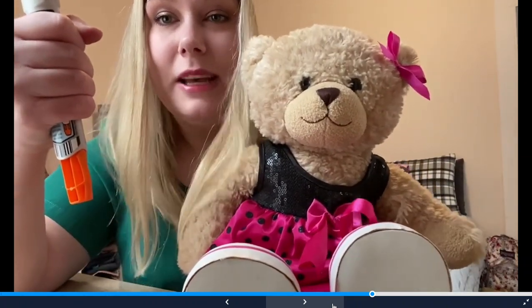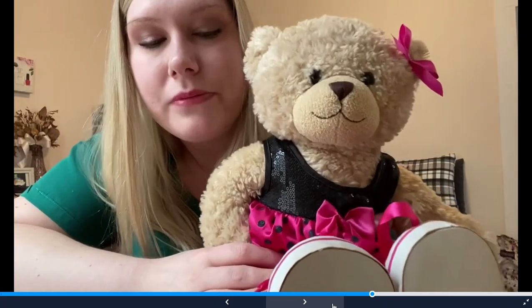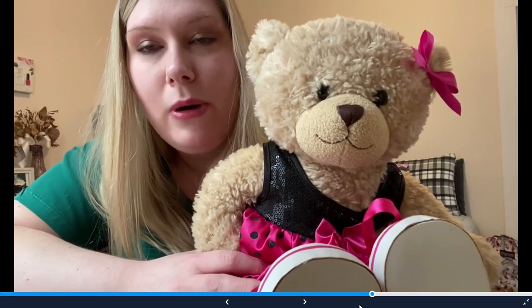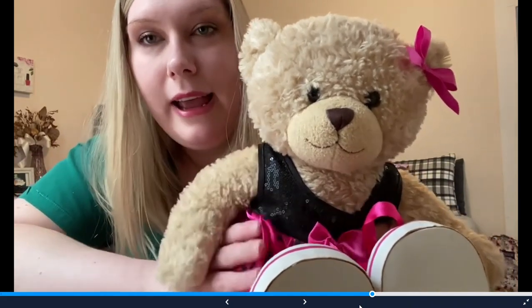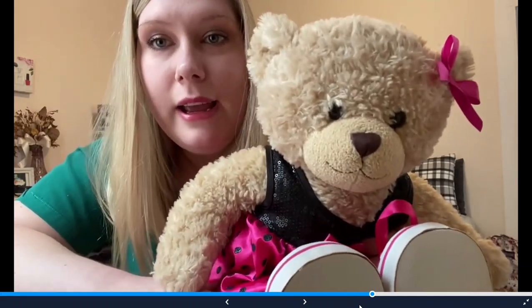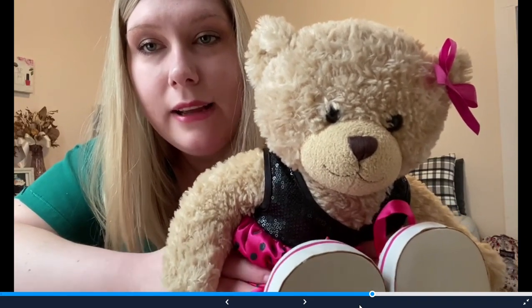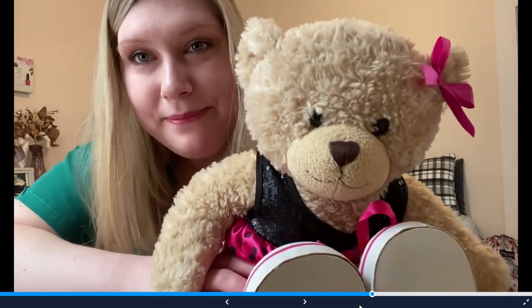And now that you've seen it demonstrated on a bear, it's time to look at a video that demonstrates how to do it on a friend of your own age. Now remember, different EpiPens require different amounts of seconds to count and even sometimes talk to you. So the EpiPen will determine how long you have to hold it into the leg, and you'll be all set, okay?